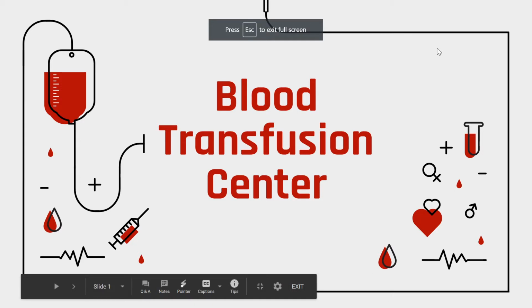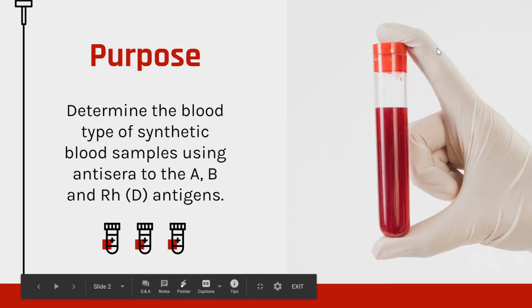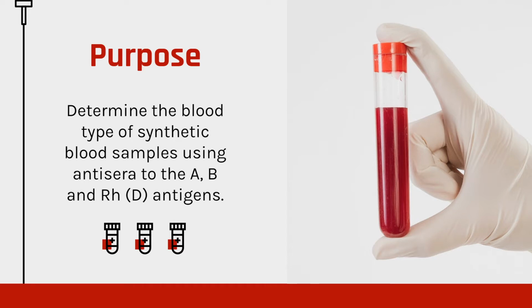Welcome to the Blood Transfusion Center. Today we're going to determine the blood type of synthetic blood samples using antisera to the A, B, and Rh antigens.